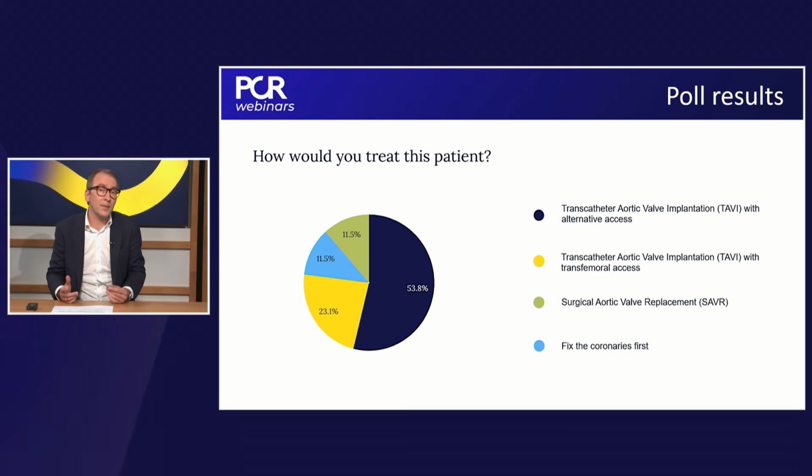Yeah. But so it's really, and we already had this discussion a little bit, when to fix, do we fix everything? Do the symptoms improve? That's what we do, right? Yeah. If the symptoms improve and there's no angina, usually, we'll take it step by step.